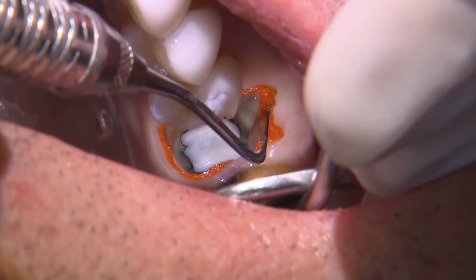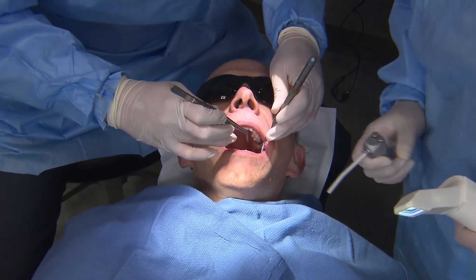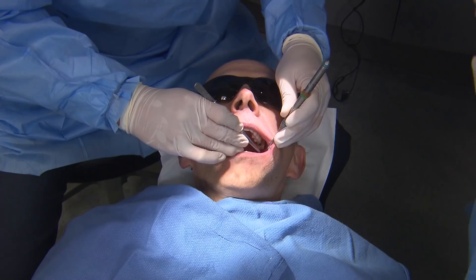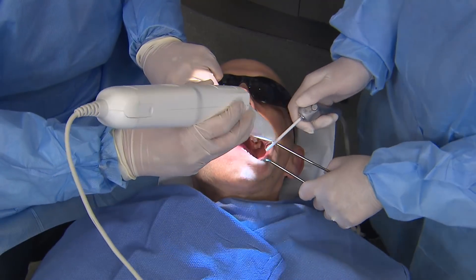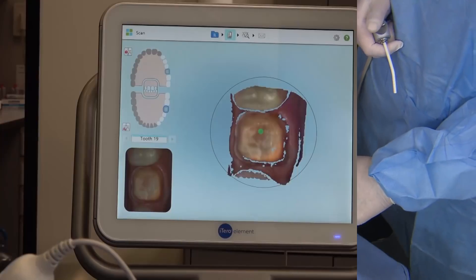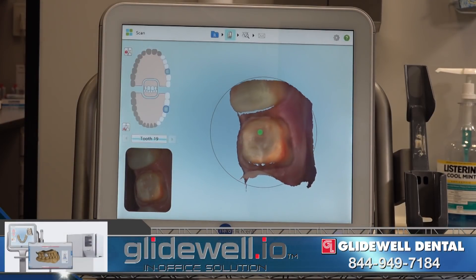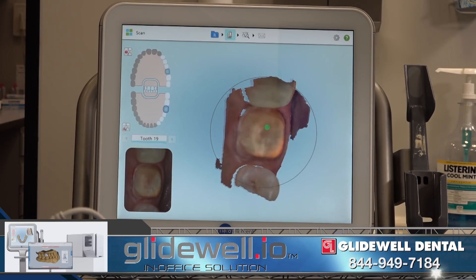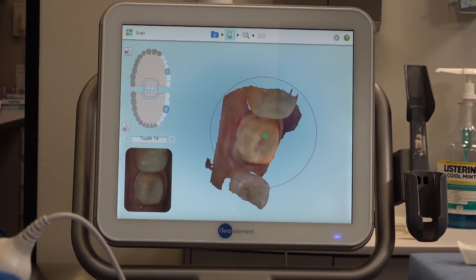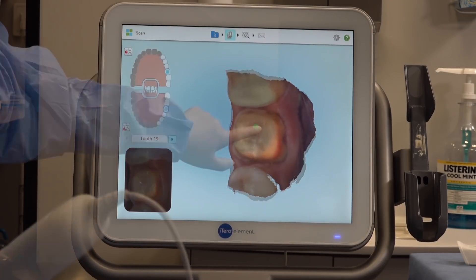After having set for several minutes, I remove the retraction cord from the lower molar to expose the space between the prep and tissue, which is exactly what we want for an accurate impression. Once the cord is removed, we dry the site very well and begin our digital impression with the iTero Element. We first take a high-resolution image of the prep, then add in the rest of the adjacent teeth to complete the lower quadrant scan.